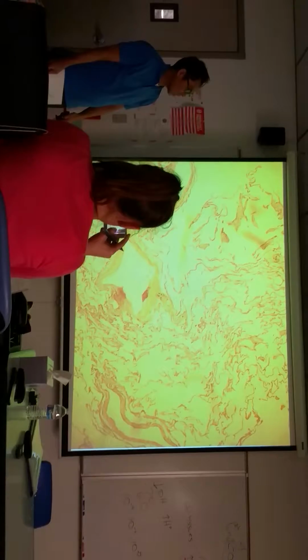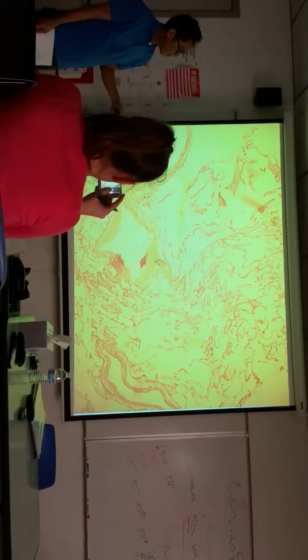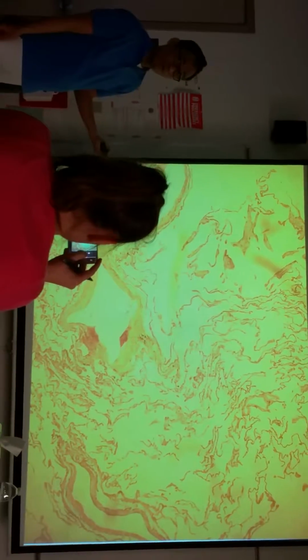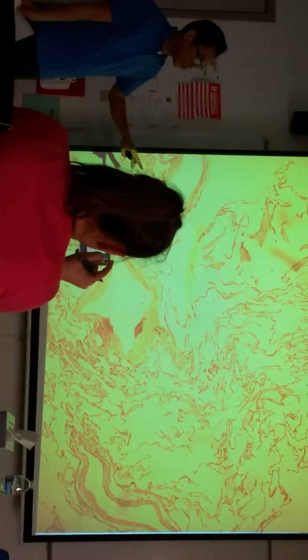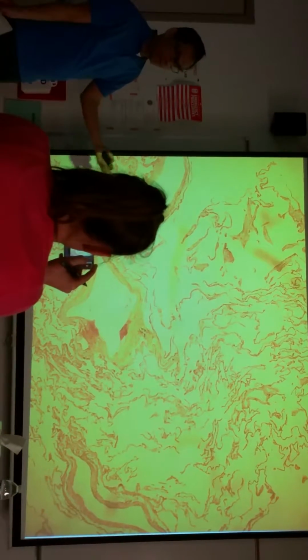Oh, this is diseased lung. Okay, let's go back. Normal lung, emphysema lung. Do you see a difference? I should hope so. If you don't, you're in the wrong field here. Okay, this is obviously not good. There's no structure here. All the alveoli look really terrible.